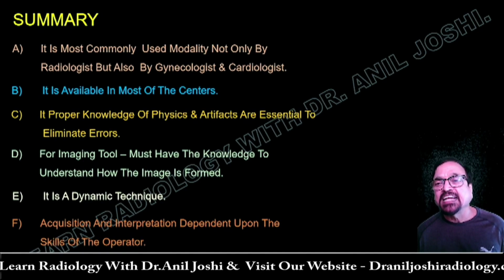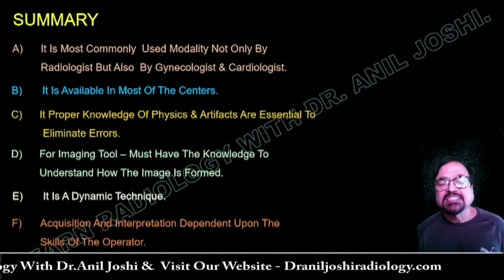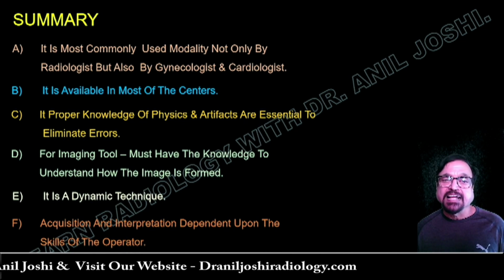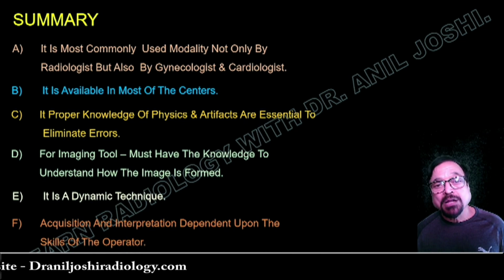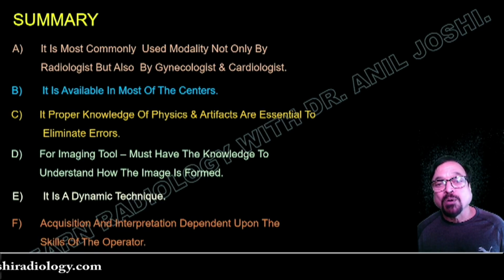The acquisition and interpretation depend on the skill of the operator. The operator can easily mislead. He can show a pathology which is not there, or he can obscure a pathology.